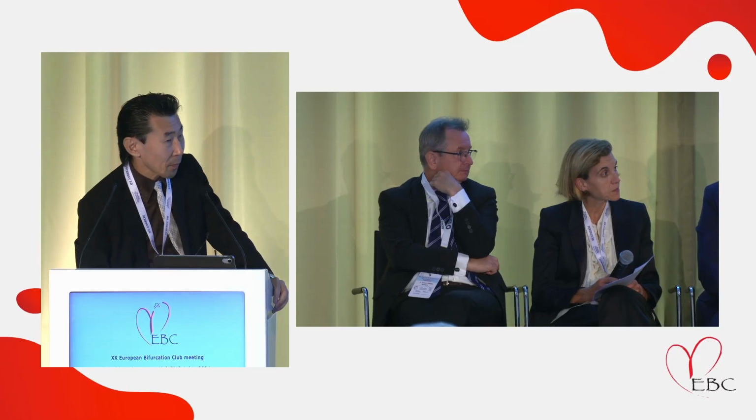Congratulations. I think this is really, really novel work. Congratulations to both you and Dr. Nakamura. In terms of your computer simulations, though, I think one of the key things when you're thinking about wire bias is that it will very much depend on the nature of the wire that you use. If you use a very flexible wire, you may get very different wire biases than if you, say, use a rotastiff wire. So does your model take into account the characteristics of the wire?